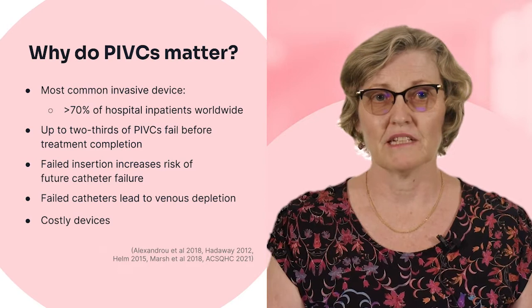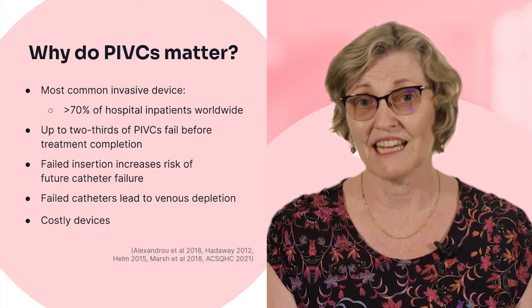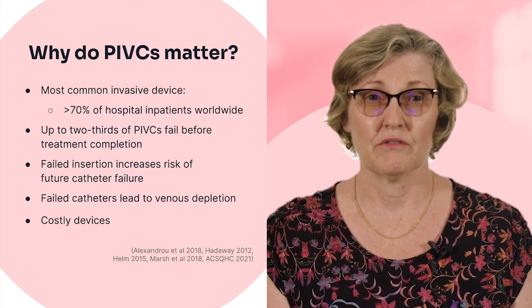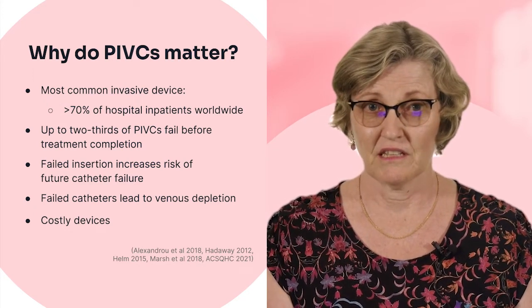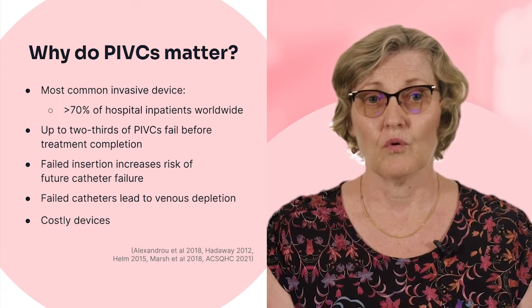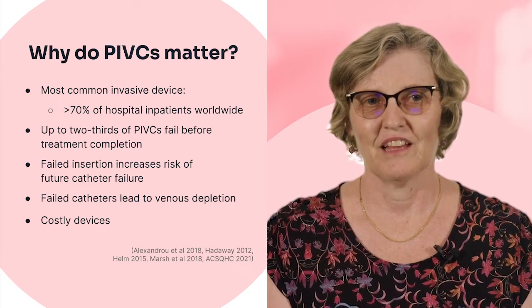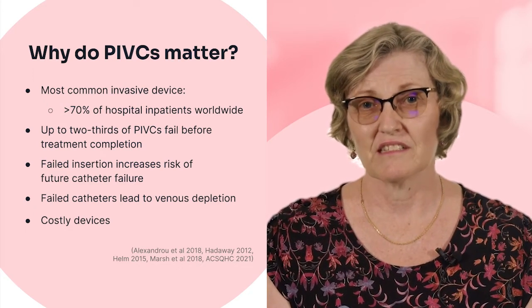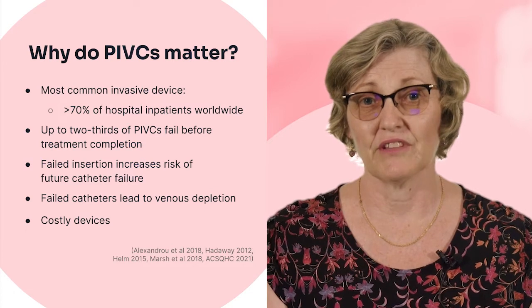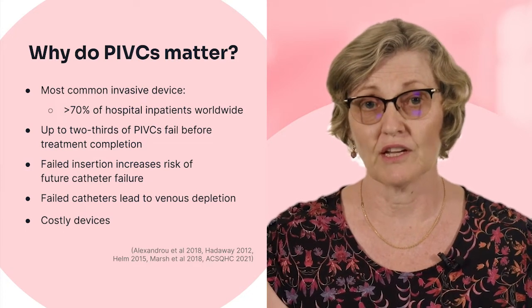So why do PIVCs matter? Well, they're the most common invasive device, and over 70% of hospital patients worldwide will need at least one. Did you know that up to 2/3 of PIVCs will fail before the patient completes their treatment? And that means that the patient will need another IV inserted to complete their treatment, or they may have further complications down the track. For example, failed insertion increases the risk of future catheter failures, and repeated failed catheters lead to venous depletion and the need for more invasive and costly devices, such as central lines.